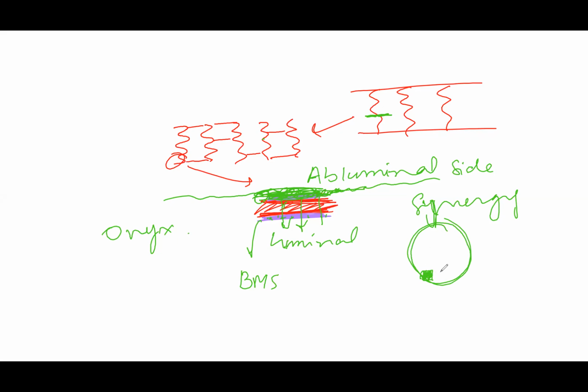When the blood is flowing, it's going to hit this, and there is going to be turbulence here. The bigger the strut is, the more the turbulence is and more risk of endothelial injury and stenosis. So that's the theory.